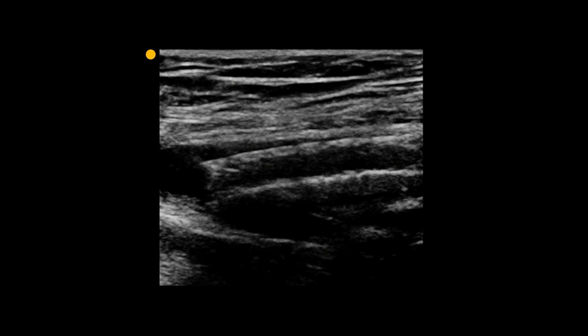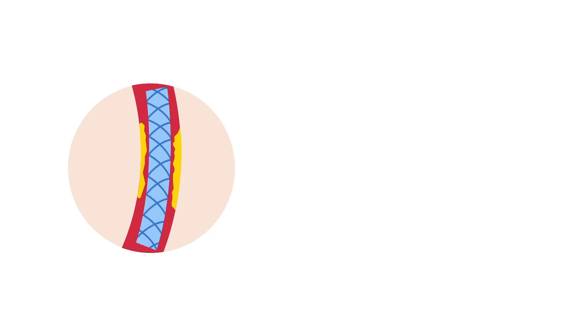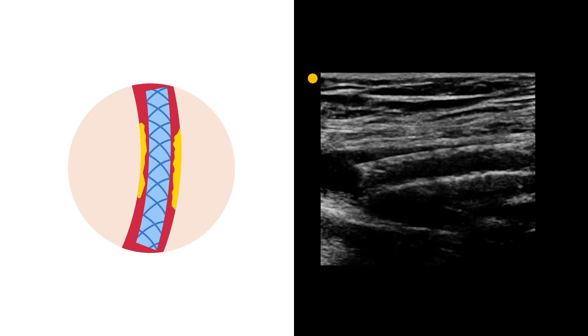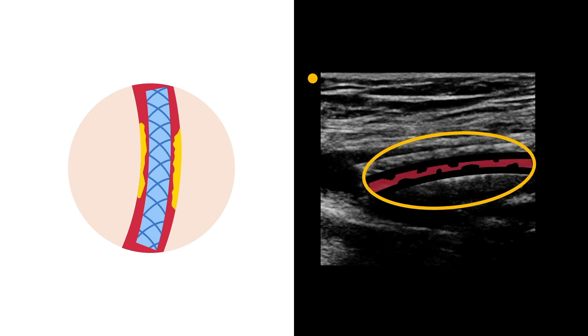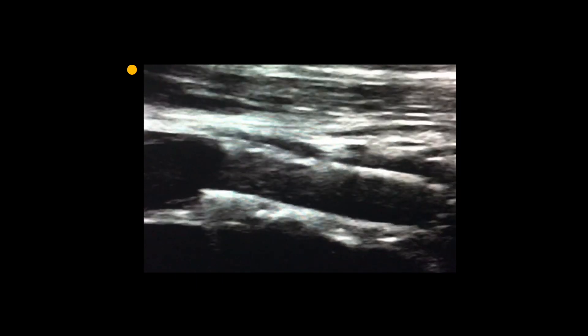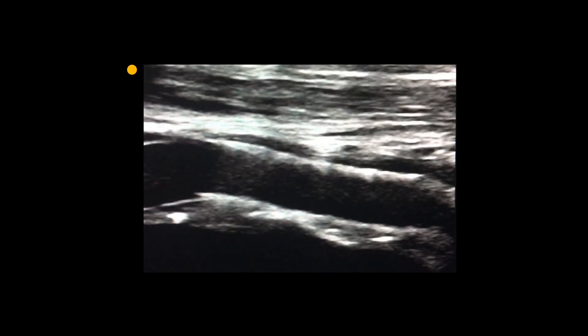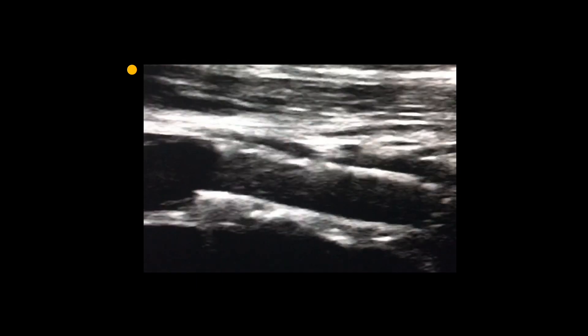Here is a stent in the SFA. Notice its bright, echogenic borders. Stents are most easily recognized at the proximal attachment. Occasionally, they can be difficult to evaluate for both presence and patency due to the calcific shadow from atherosclerotic plaque pushed up against the walls. When off-axis, you can usually recognize a stent by identifying the mesh pattern.